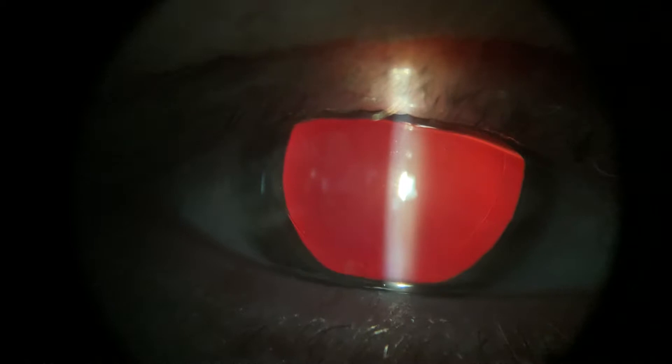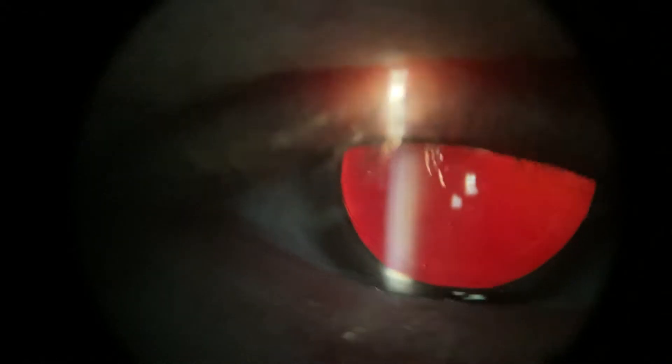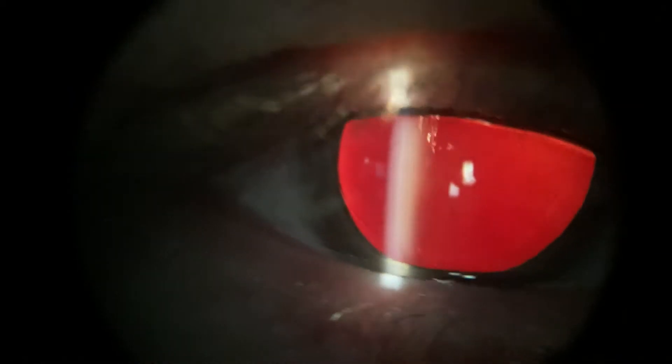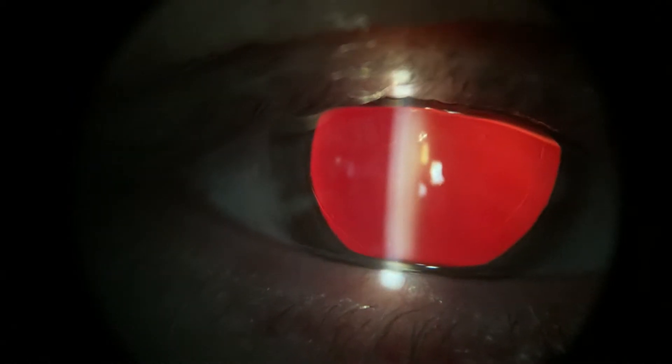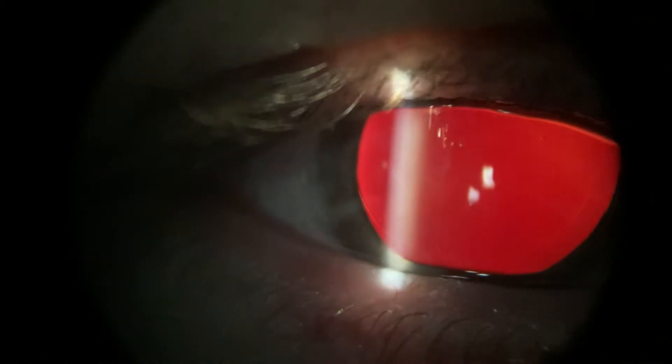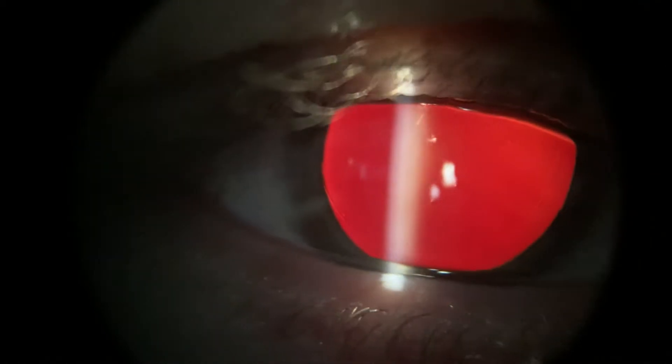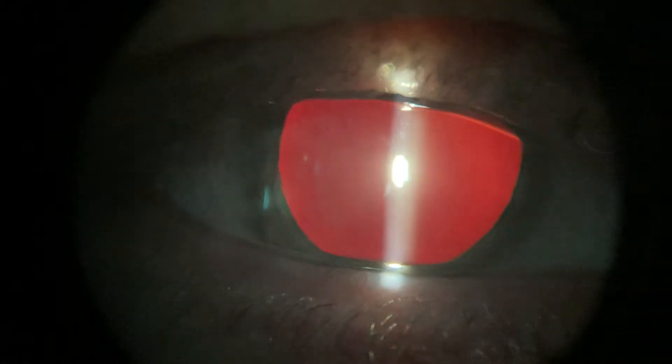Now looking at that red reflex, is there anything that pops out to you? Anything that you can notice? You need to look very carefully. What you can actually see is there is a LASIK flap, which is really interesting.